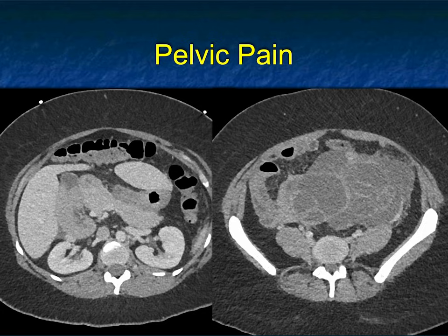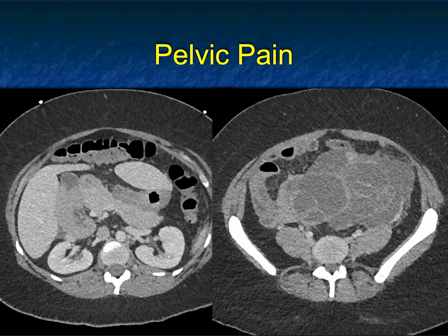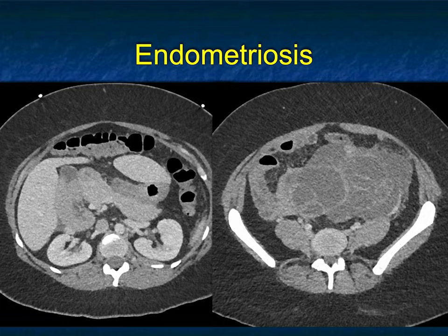This patient has pelvic pain, and you can see a complex cystic mass arising out of the pelvis. This was a female, so you could say ovarian cancer — that would be a good thought — or you could think about metastasis to the ovaries. But one of the things you always need to think about, particularly in a patient with pelvic pain where the history doesn't seem to match malignancy, is endometriosis. Endometriosis is a great mimicker — it can involve the ovaries, present with torsion, bleeding, and large masses looking like malignancy. This patient had surgery and this was endometriosis. If you don't think about it, the patient will go to surgery and the workup will be for cancer.